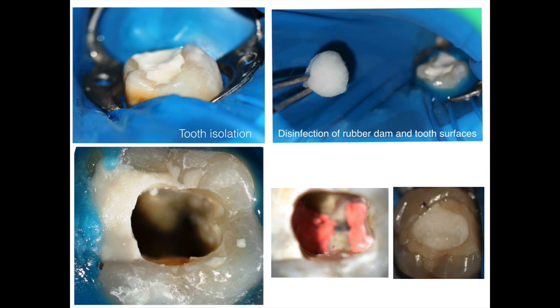Before starting any endo treatment, as you know, there's no endo without rubber dam. After applying my clamp with rubber dam, I disinfect — using alcohol to clean the tooth surface and the rubber dam as well. The most important point here is to change gloves after you apply the rubber dam, because you don't want to reintroduce saliva inside the tooth. These are the aseptic controls that quickly and easily increase your success rate, since the whole goal of endodontic therapy is to control and remove microbes from inside the tooth.